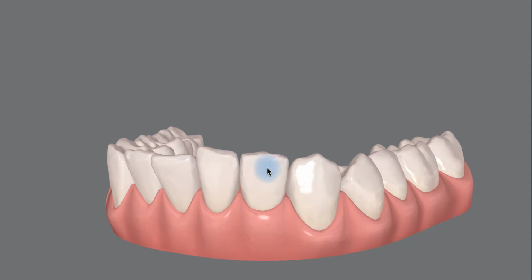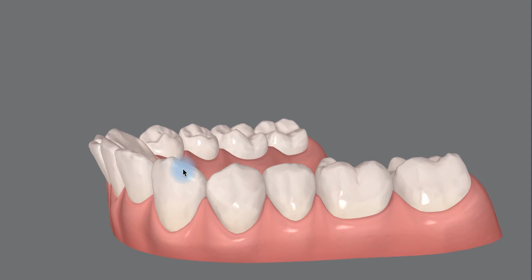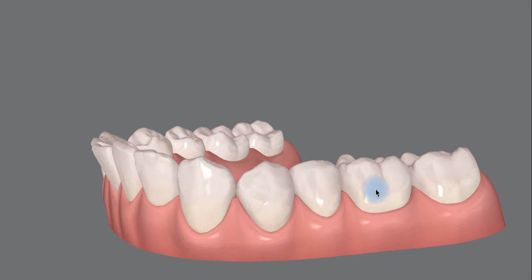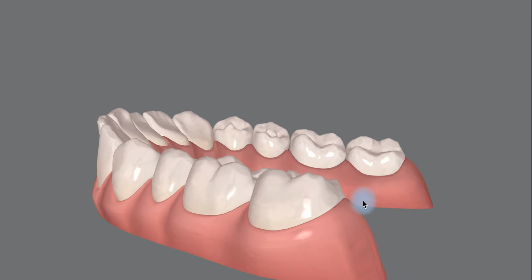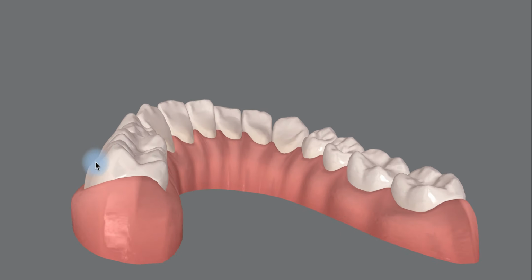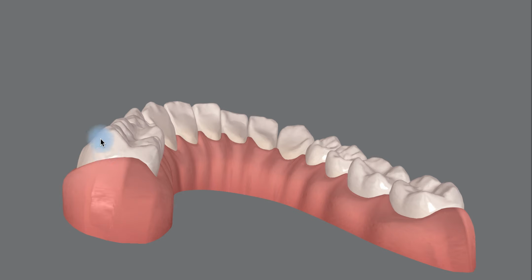With that said, I was kind of moving around like this, and I saw this wear facet, or what could be a wear facet. And this is not a common location to have a wear facet. And then also right here. It's a rather flat surface to a tooth where there's no other signs of attrition, erosion, or any sort of tooth degradation. For that tooth to have that flat surface, I have to surmise that somehow got there from a biomechanical means.